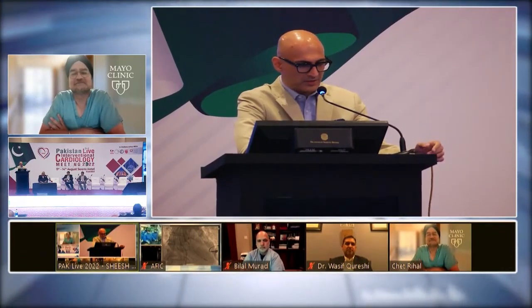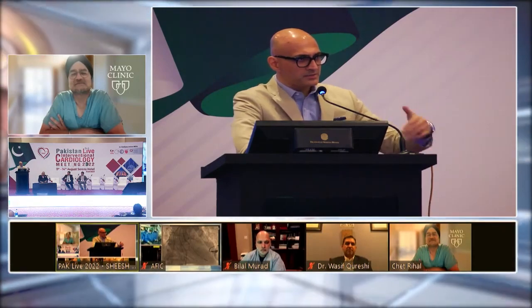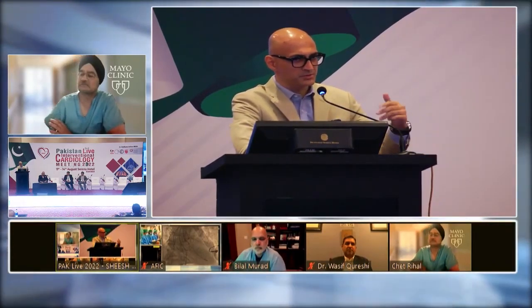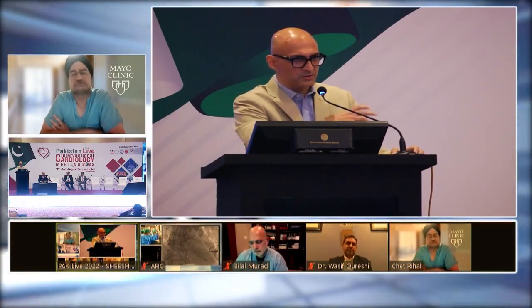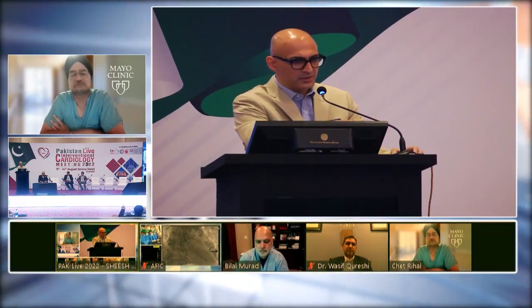I have a question. We have Bilal Murad online, and I wanted to get Bilal's thoughts. As these devices get better and better, at least in the aortic valve space, there's a lot of downward creep in terms of the age cutoff. We're doing younger and younger patients, and the heart team discussions are more and more about planning for the next valve rather than just the first valve. So what are some of the considerations you take into account when you have a relatively younger patient who is going to get TAVR, and you think about what they're going to need in about 10 years' time?